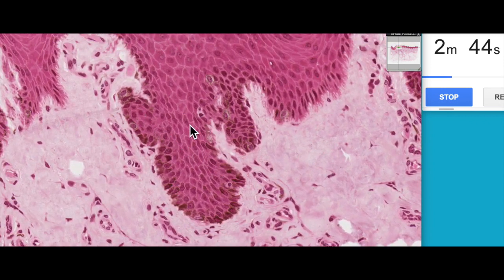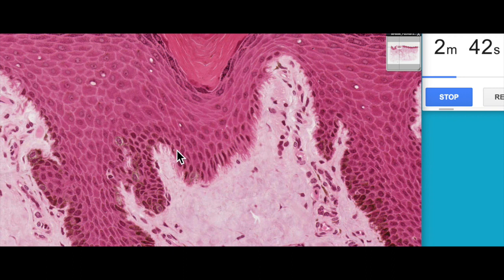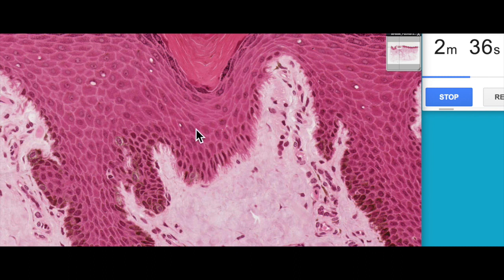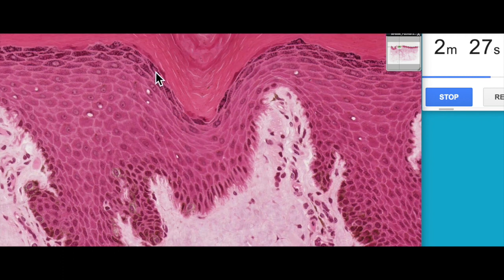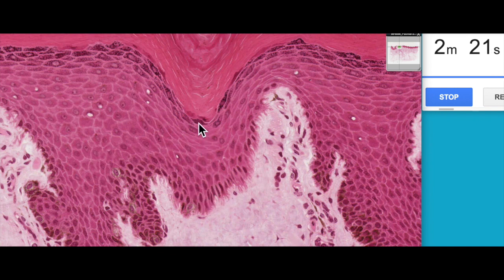We can subdivide the epidermis into four or five layers. We've got the stratum basale, where mitosis happens and all of the cells that make up the rest of the epidermis originate from the stem cells here. Then we have the stratum spinosum and the stratum granulosum — these three layers make up the living cell layers of the epidermis.